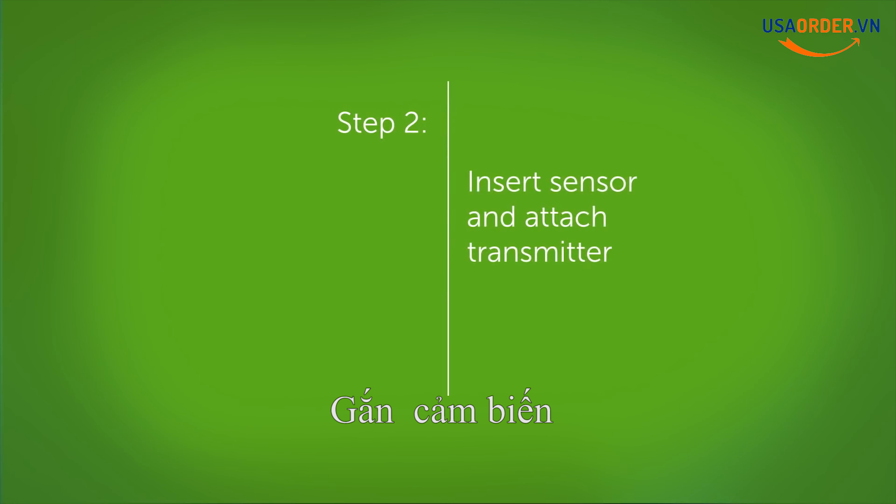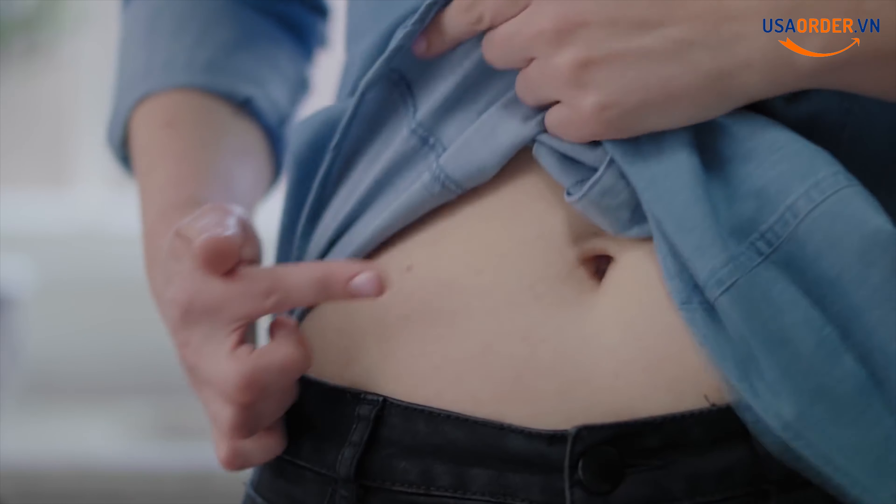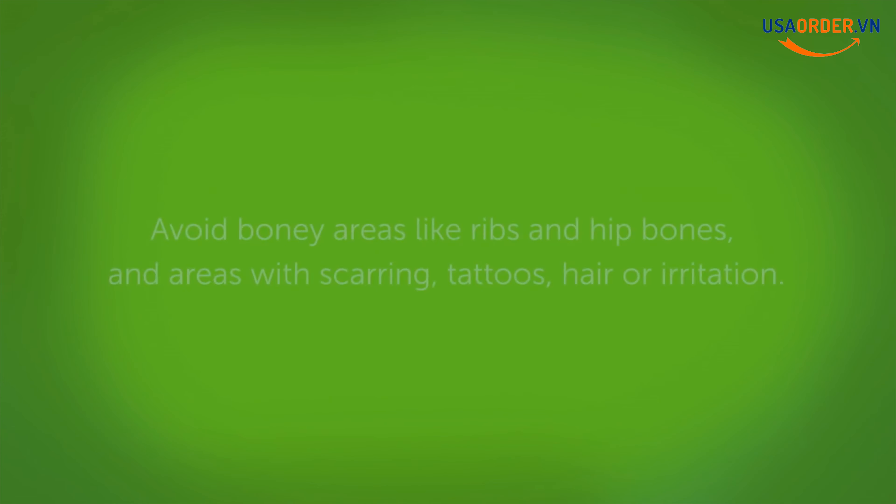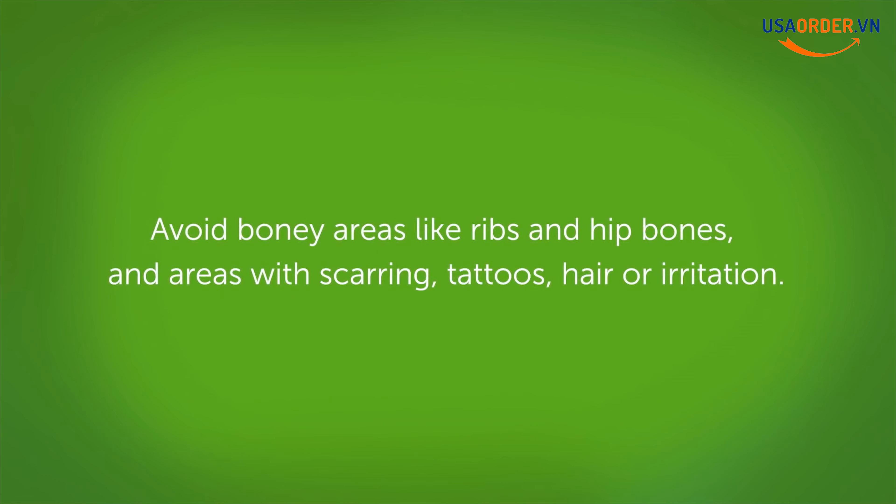Insert your sensor and attach your transmitter. To insert your sensor, first choose the place on your body. You have the option to place it on your upper buttocks as well. Use a site at least three inches away from the insulin pump infusion or injection site. Avoid bony areas like ribs and hip bones, and areas with scars or irritation.